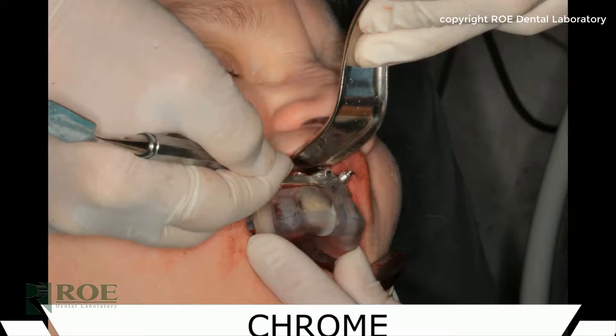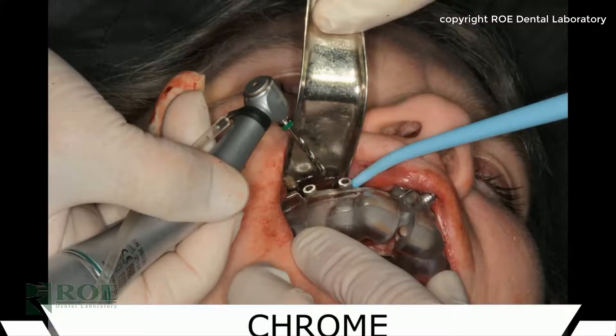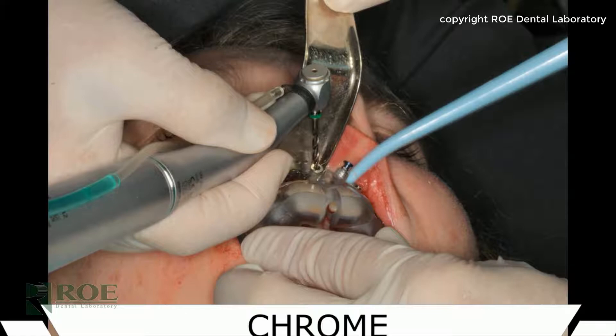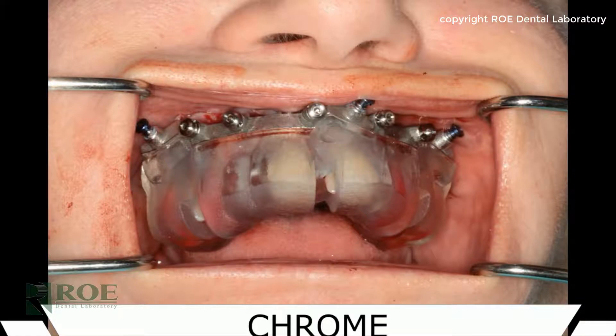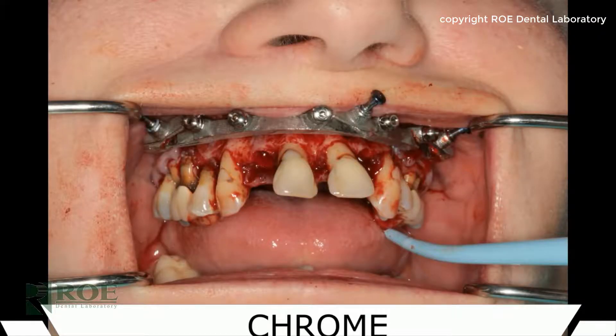At this point the pin guide is held very firmly against the teeth through the whole process. The sites are drilled one at a time — drill a site, place a pin, drill the next site, place a pin — until all the pins are perfectly seated. Then the pin guide can be removed.